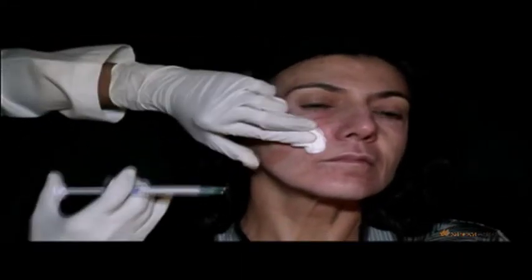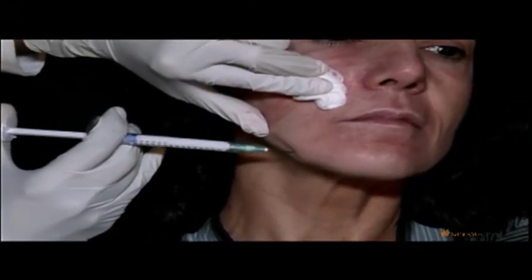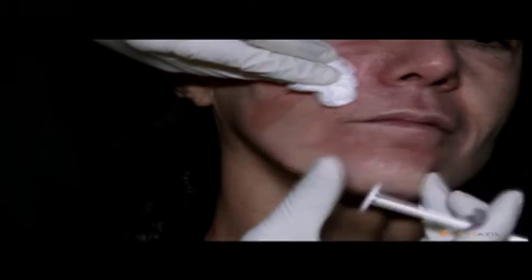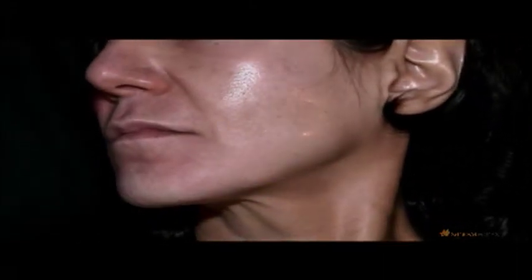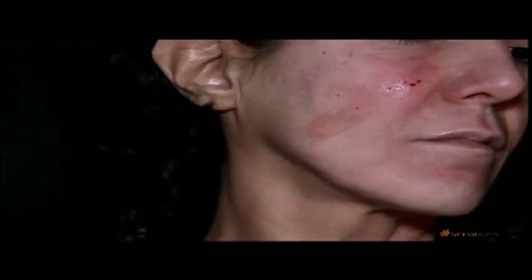If we look now at Katya's jawline, I'm going to go down again to the periosteal layer, or just above that, supraperiosteally. I insert the needle to make a tunnel deep, and then I pull back and inject as I pull back. This is retrograde tunneling technique. And now I've injected 0.2 of a cc. And again, if I turn Katya, look at the side that I've injected compared to the uninjected side. And hopefully you can discern a little bit of improvement there. That's really sharpened up her jawline.